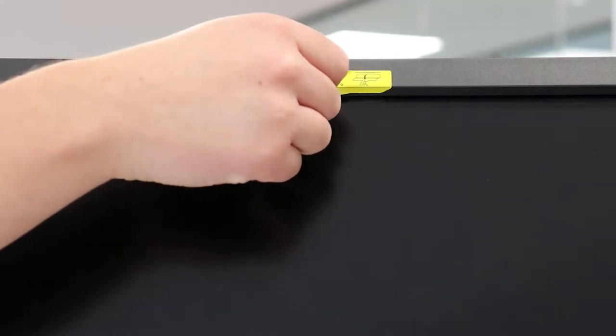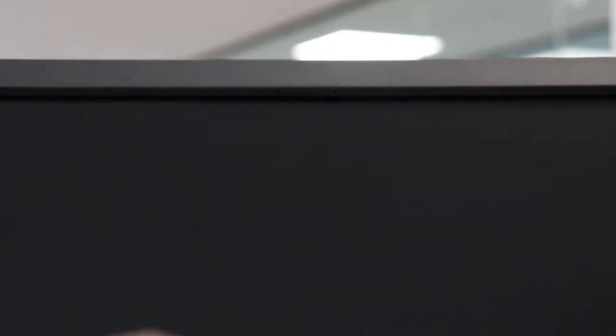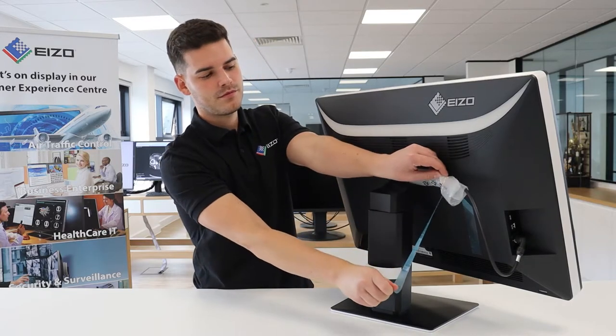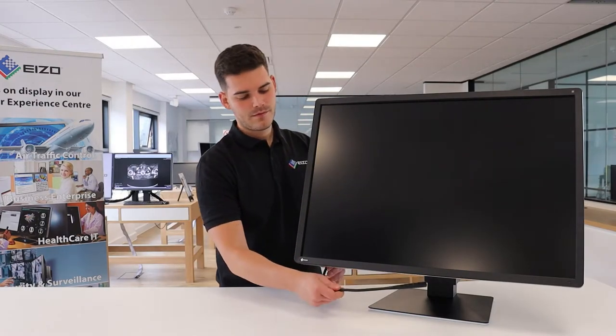Then remove the integrated front sensor seal located at the top of the monitor. Detach the comfort reading light from the rear cabinet and position it to your preference.